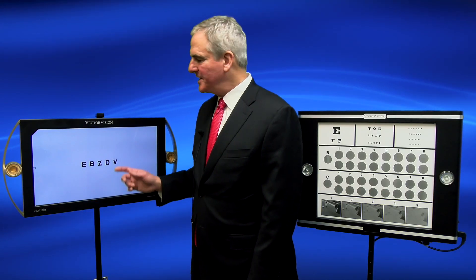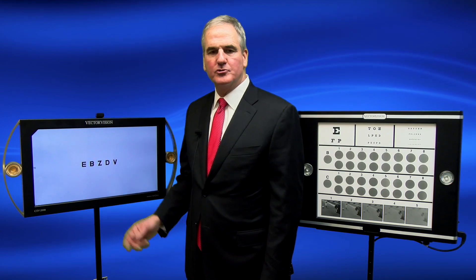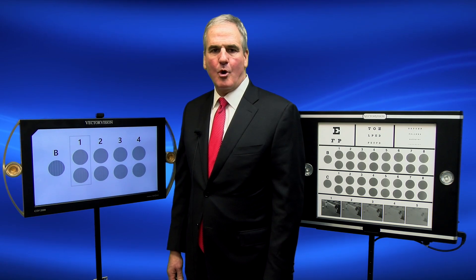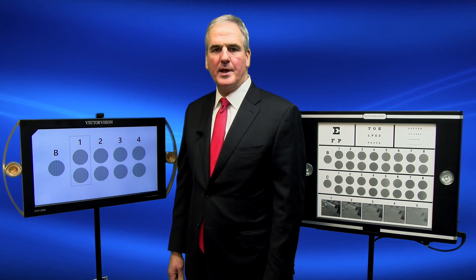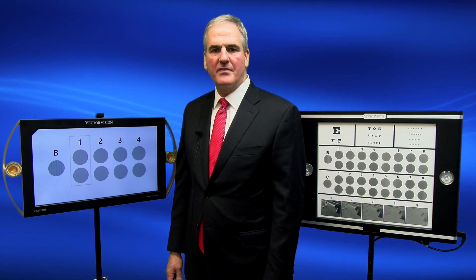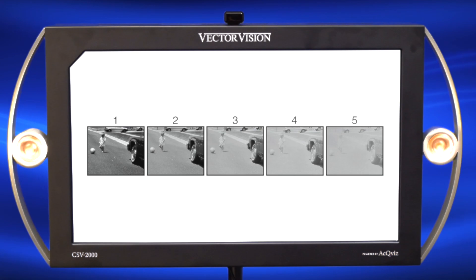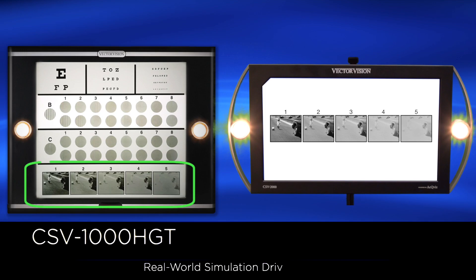With the CSV 2000, you can easily switch via remote control from any vision test to contrast sensitivity and then to Row B. Row B uses exactly the same contrast levels as Row B on the research-proven CSV 1000, thus ensuring consistent and accurate results.